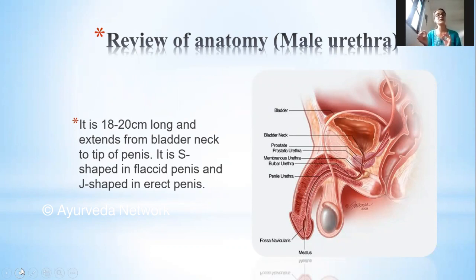catheterization. What you will be doing here is inserting the catheter via this meatus up to the urethra, and you will be taking it a little inside the bladder, right? So it's very important to discuss the urethra. First we'll discuss the male urethra.